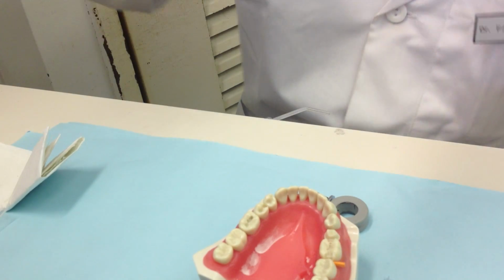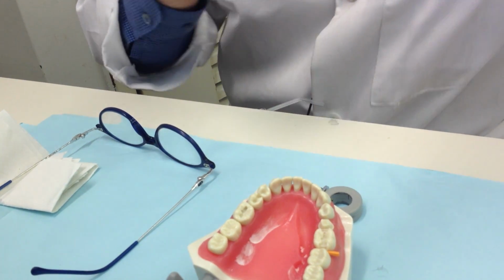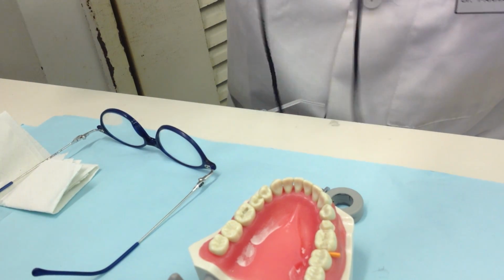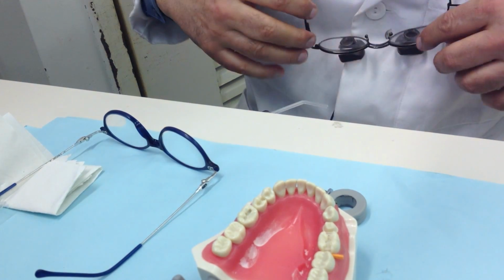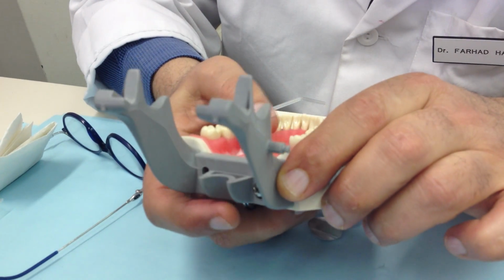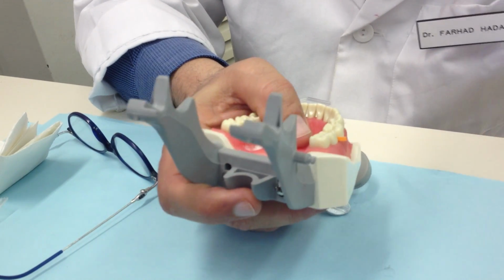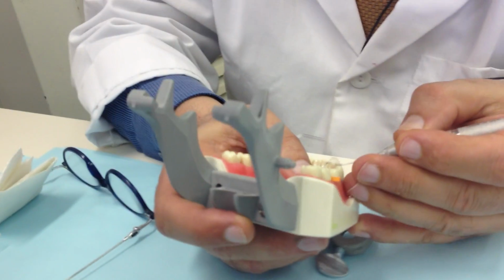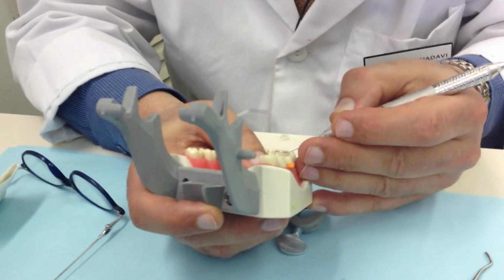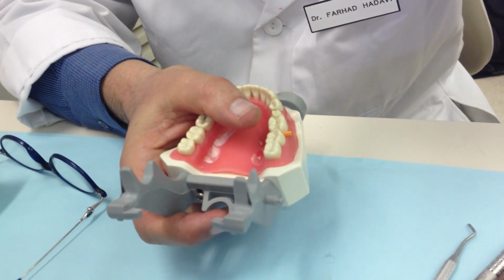Now let's evaluate this wedge. Now I can see the relation of the wedge with the gingival cavosurface margin. Let's see over here. Now when I look at this one, I can see my wedge is tight around here, correct? It is nicely tight around here. I have a good seal. Can you see that one over here?